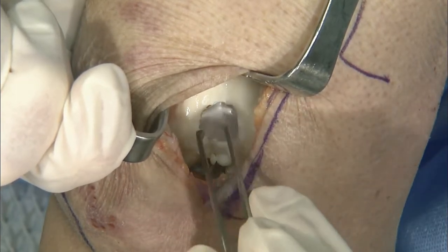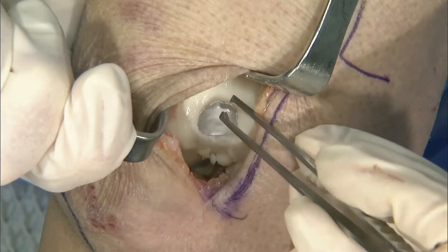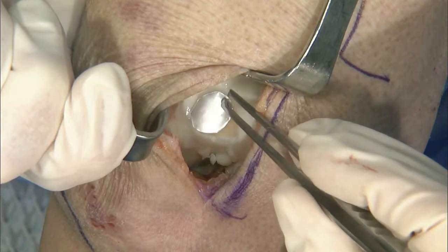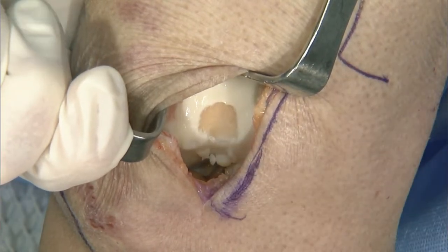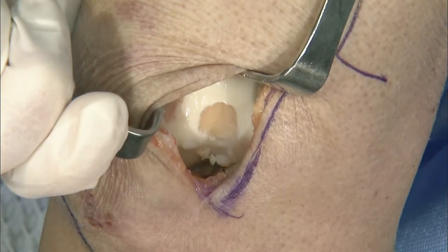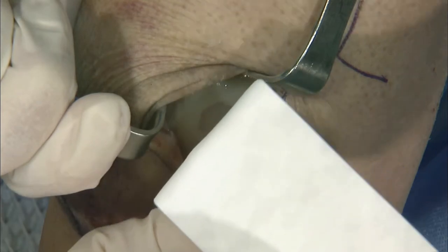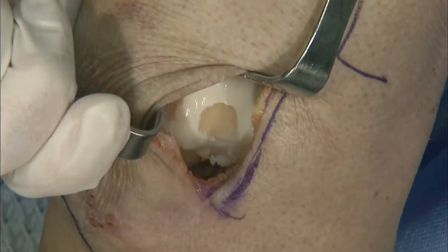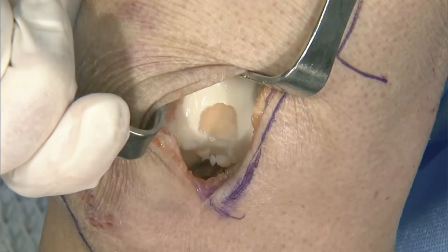Do you use the Telfa Tegaderm, or not a Telfa Tegaderm, but just a regular Tegaderm then to place that in for cutting? Have you ever put that in? The paper. Oh, yeah, the paper. Sorry, I didn't know what you were talking about at first. I actually just use the back side of the suture container here. But I think the backside of the Tegaderm works fine too. Both of those work.